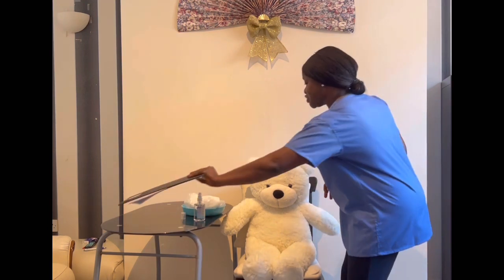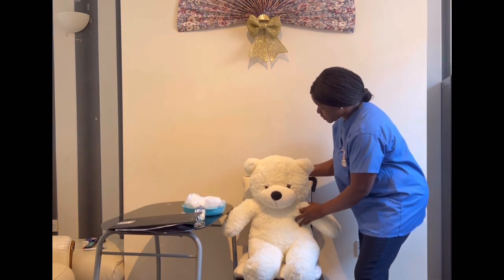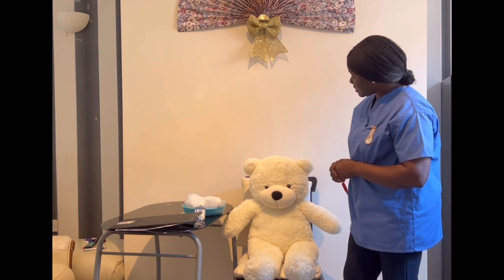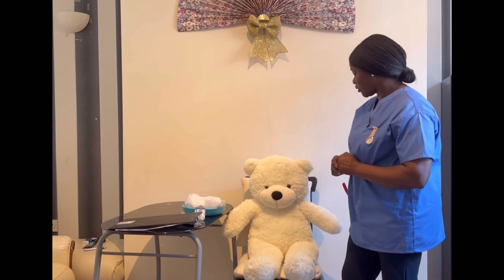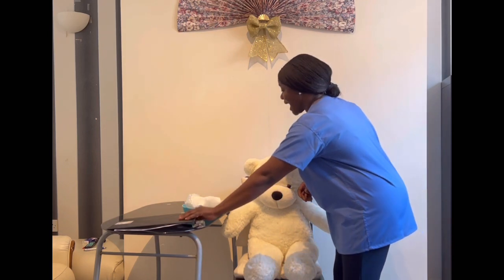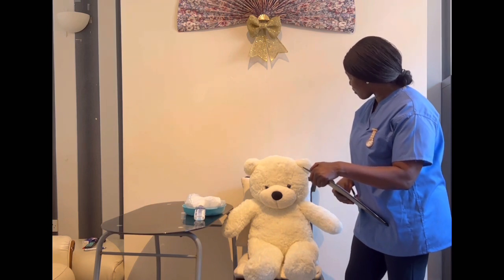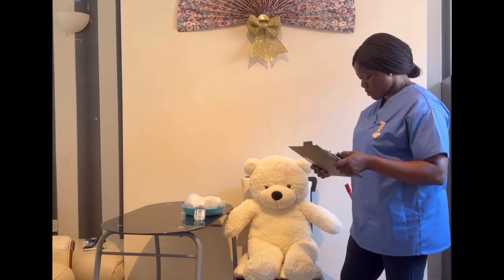Is it okay just to reposition you and support you with a pillow? Yes, nurse. Can you inhale deeply? Take a deep breath. How do you feel now, Harry? Yeah, a lot better. Great. Are you still happy for me to go ahead? Yes, nurse. Okay, thank you. I'm still going to have a look at your document. If you are due for any medication for pain, I'll be back to give that. Is that all right with you, Harry? That's fine, nurse. Thank you so much, Harry.